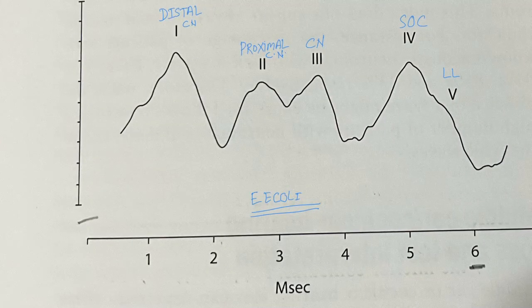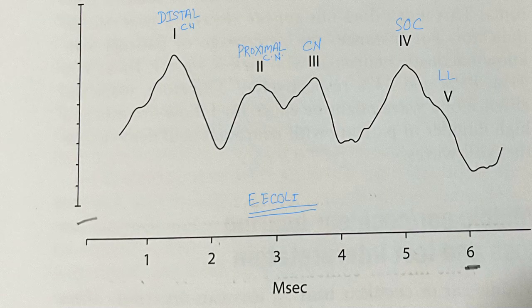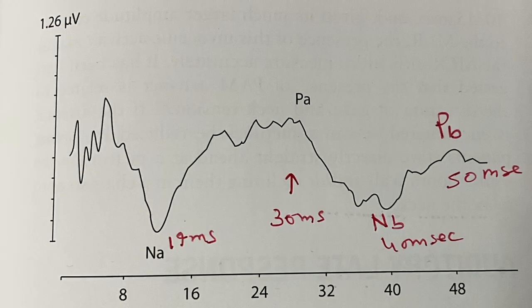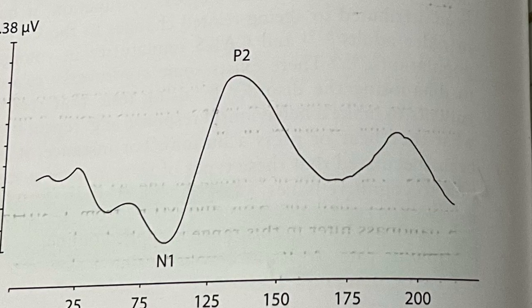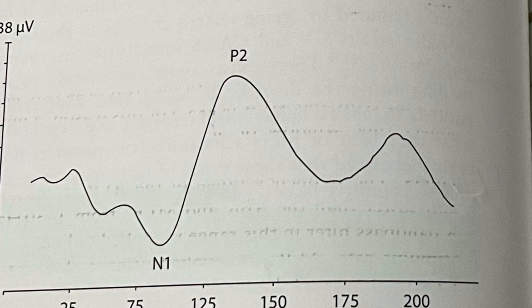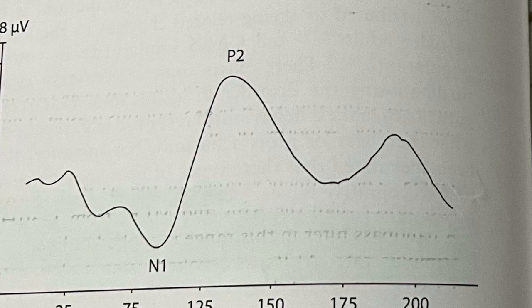Finally, sensitivity to pathology varies. ABR detects brainstem disorders. MLR identifies central auditory dysfunction, while ALR reflects cortical and cognitive impairments like ADHD. In summary, ABR, MLR, and ALR serve distinct roles in auditory and cognitive evaluation, helping clinicians tailor their use to specific needs.